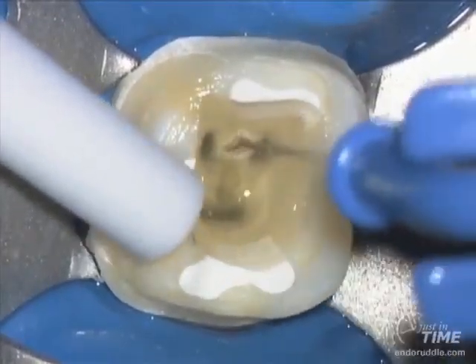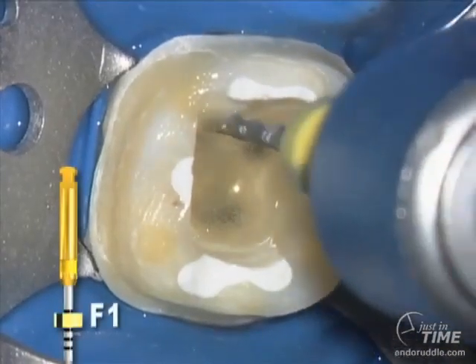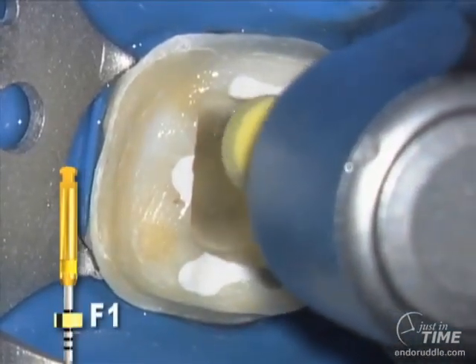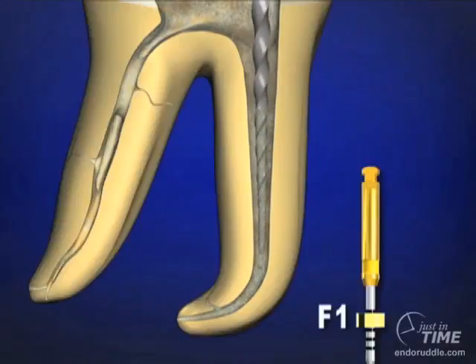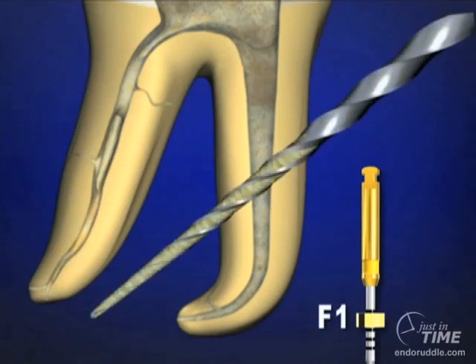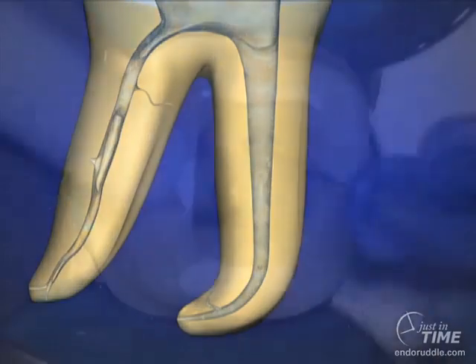This is the first finisher. It's the 2007. It is not a brush. It moves straight into length again in one or more passes. Notice where the debris is loaded. On a finisher, you want to see debris on the apical extent of the file because it confirms this file just cut its shape in the apical third. Again, irrigate, recapitulate, and re-irrigate.